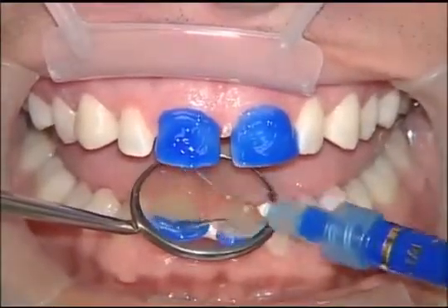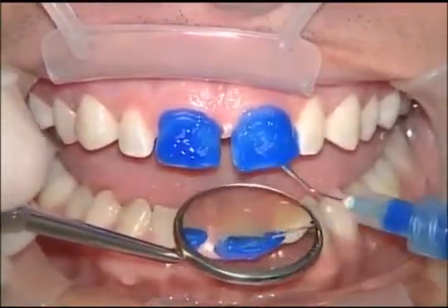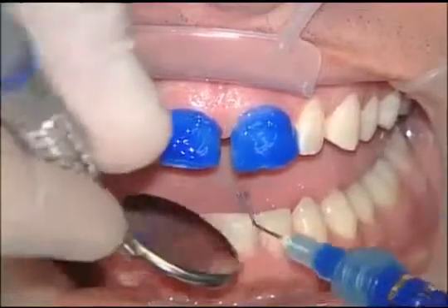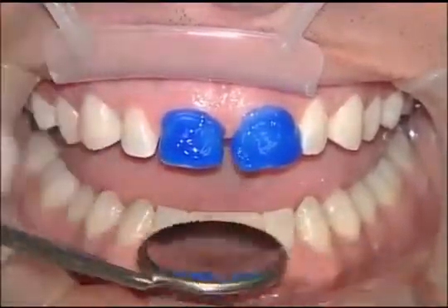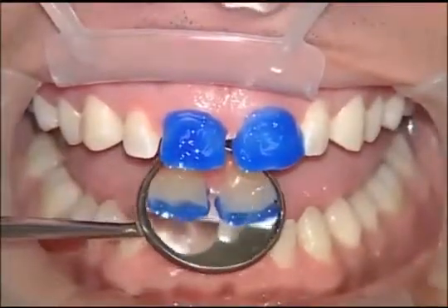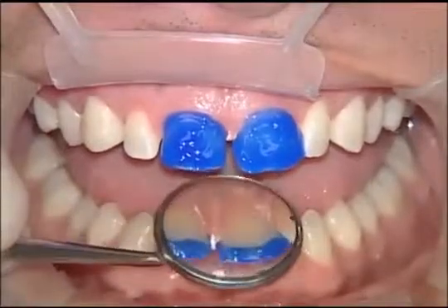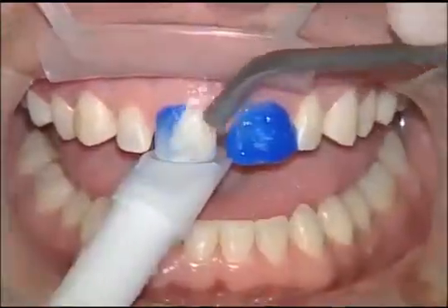Since these no-prep veneers will wrap onto the lingual surface because we are increasing the incisal edge length of all the teeth, we're going to go ahead and use a mirror just to verify that we have, in fact, got the etch onto the lingual third of the teeth. It's pretty easy sometimes to overlook that etch, but we do want to make sure we get a good bond everywhere, and we should, because we're bonding to enamel, the best bond in dentistry.